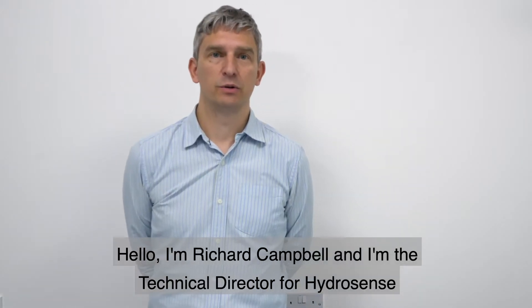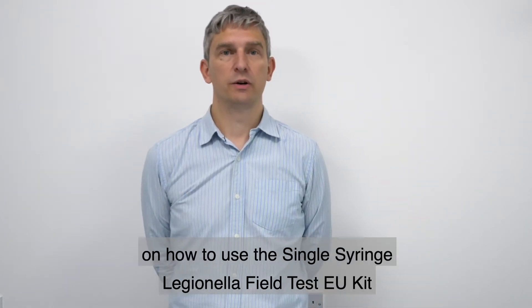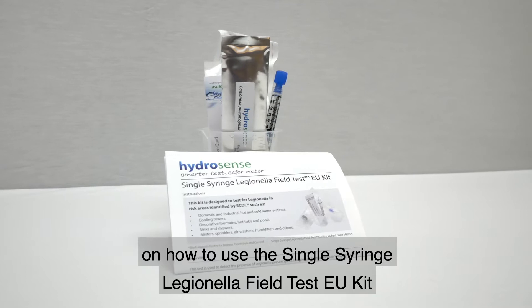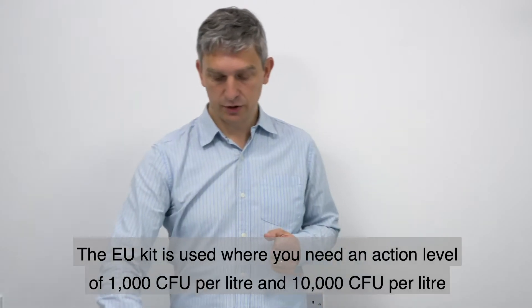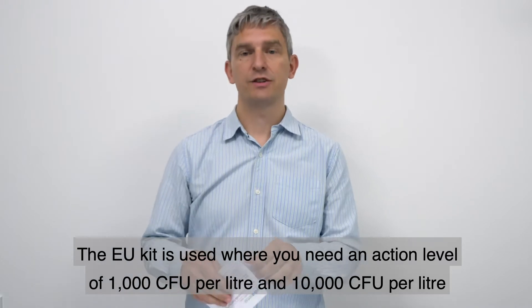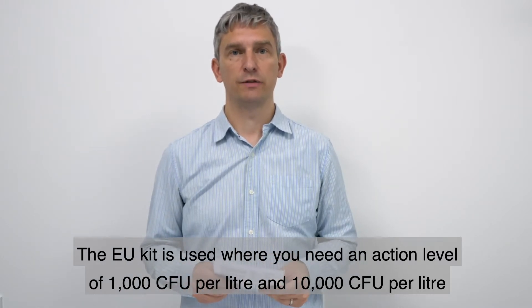Hello, I'm Richard Campbell and I'm the Technical Director for HydroSense. Today I will be giving you an instructional video on how to use the Single Syringe Legionella Field Test EU Kit. The EU Kit is used where you need an action level of 1000 CFU per litre and 10,000 CFU per litre.